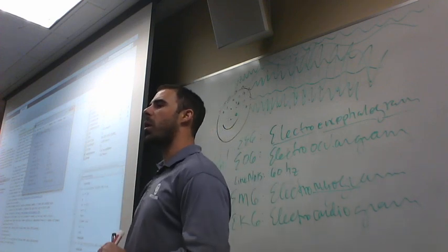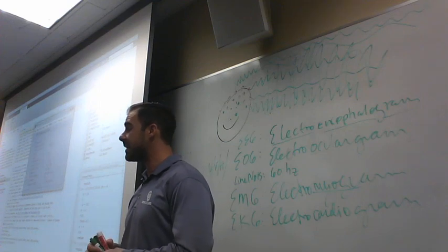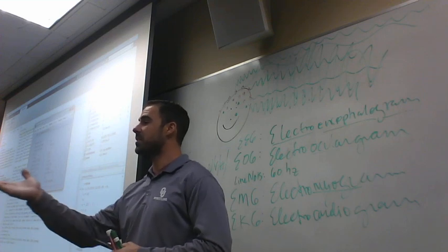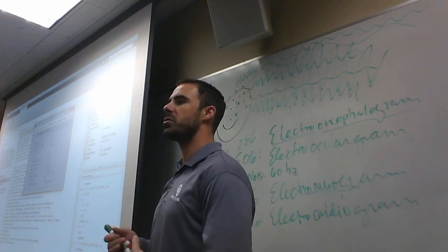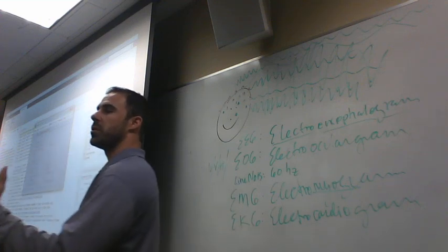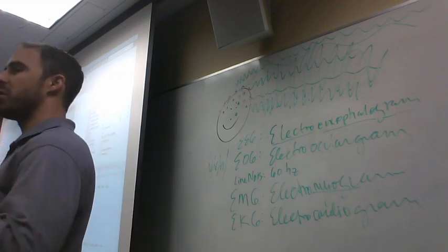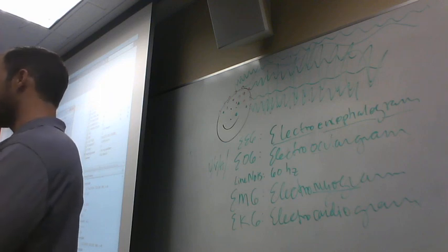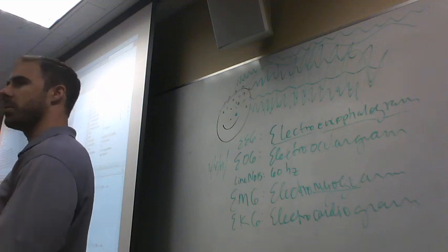But what we want to do, and why we want to have many subjects, say 25 subjects in this case, is because we want to be able to average this, and this is the very idea of what an ERP is. For every person, you average their data together, and in the averaging process, you will eliminate the noise. If you average enough trials together, all this crappy noise will average out, and you'll be left with whatever the signal is. That's the idea of an ERP. Is everybody on board with that idea, conceptually and theoretically?